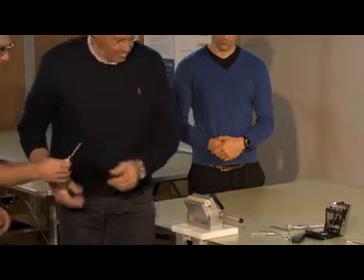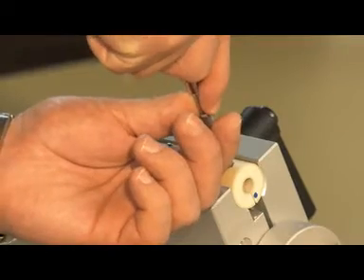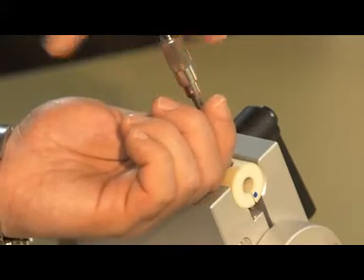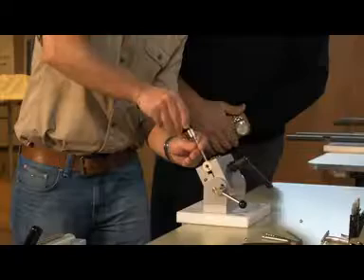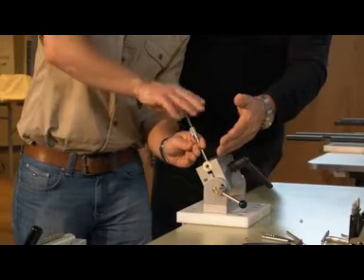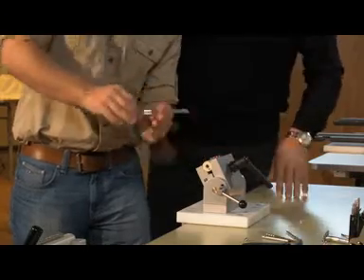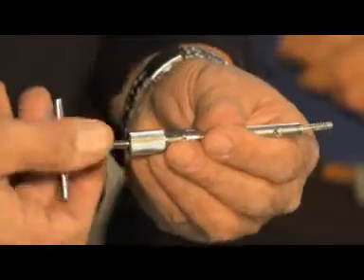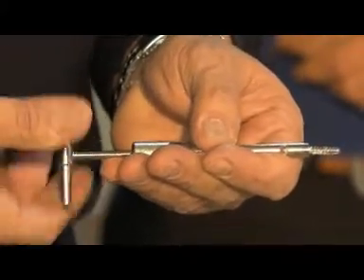Here you are. Pressure and counterclockwise. Now see if it is solid. That's right. We have engaged the instrument onto the screw. You see? By turning it counterclockwise, we engage the instrument into the metal of the screw and then we can turn it out.